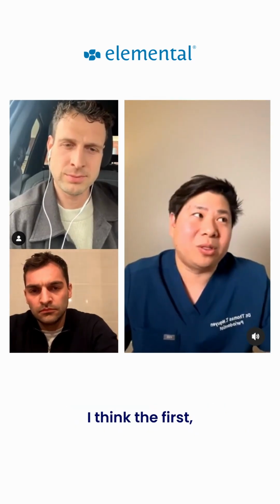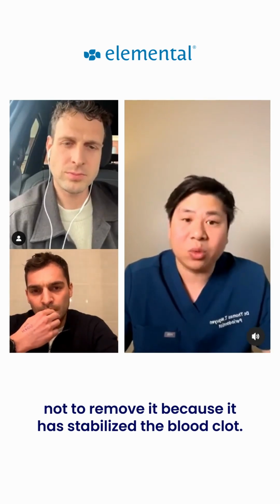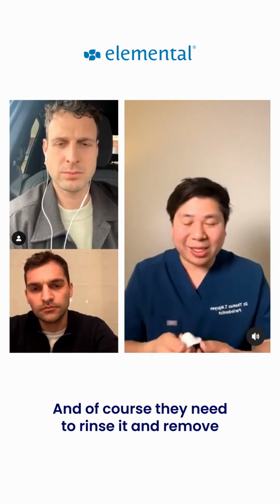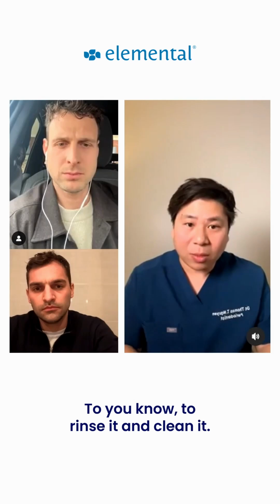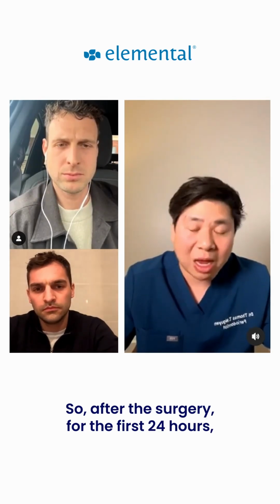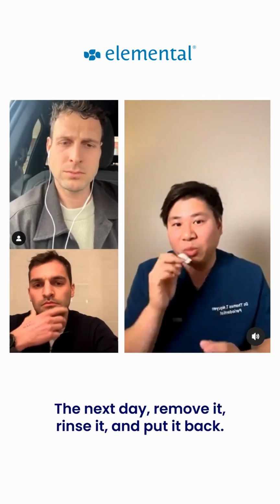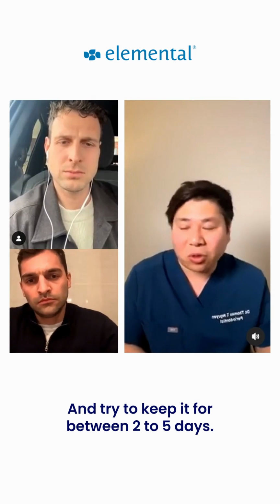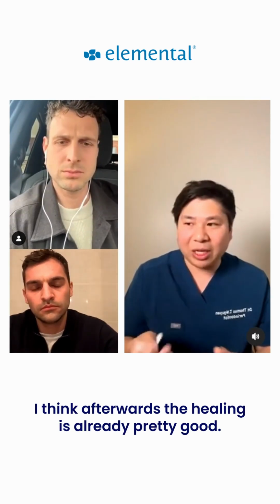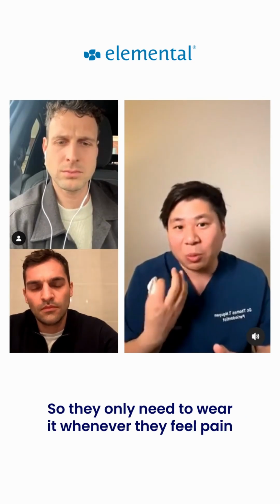I think the first 2 days are the worst. So for sure, the day of the surgery, I tell them not to remove it because it stabilizes the blood clot. And of course, they need to rinse it and remove it at least once a day to rinse it and clean it. So after the surgery, for the first 24 hours, I tell them to sleep with it, do not remove it. The next day, remove it, rinse it, and put it back. And try to keep it for between 2 to 5 days. I think afterwards, the healing is already pretty good. So they only need to wear it whenever they feel pain or they have anything.